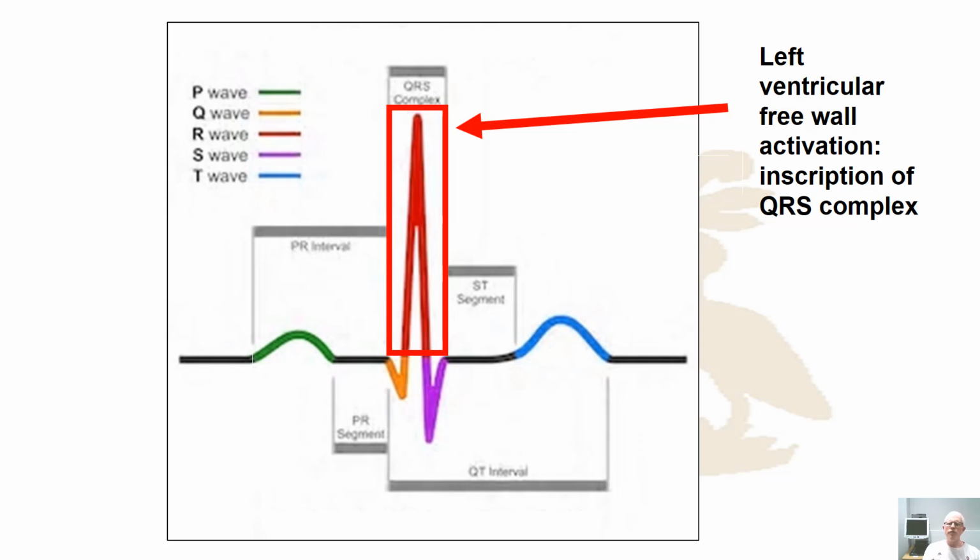It requires an incredibly forceful contraction. So you're going to get very, very high neural innervation in order to drive that. So high electrical discharge is going to be required to drive that ventricle recruitment. So you get a very high signal in the ECG trace.